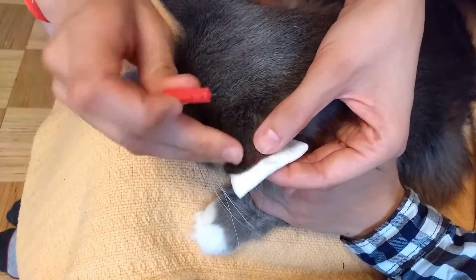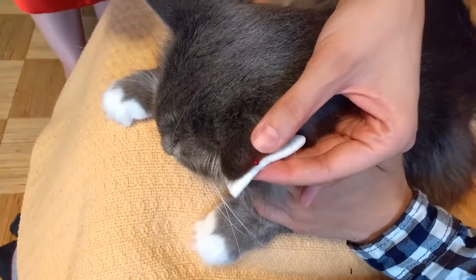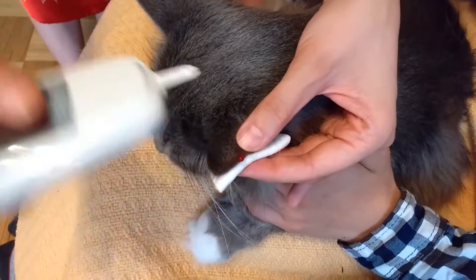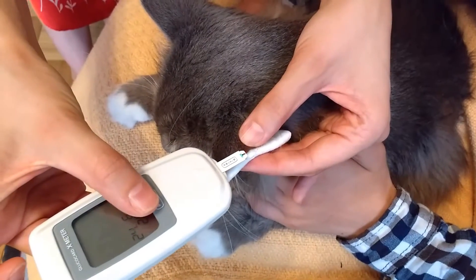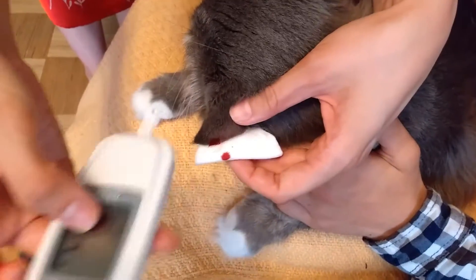One poke. And then you're gonna pump the blood out — we have lots of blood. Then you're gonna use the meter, and it's already done.